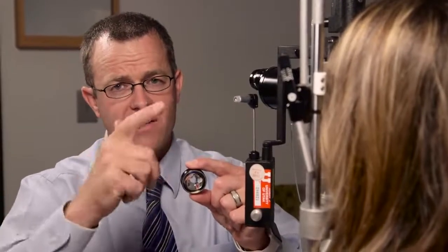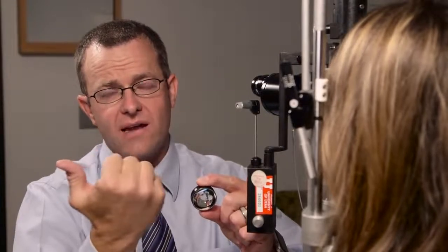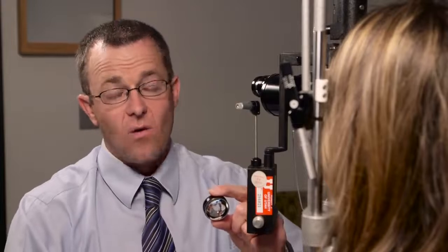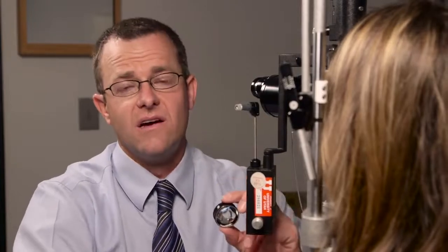And so again, a good point to bring up with that is that these lenses reverse the images up and down and side to side. So the macula is always located temporal or lateral to the nerve of the eye anatomically. However, when you're doing your exam, to see it, you're going to pull nasal or towards the nose to be able to get those into view. So after you see the nerve, you're going to pull nasal and swing the slit lamp over towards the macula to get a good view.